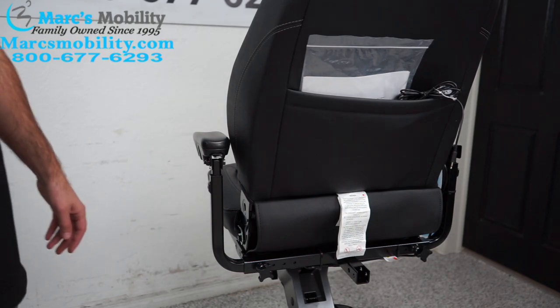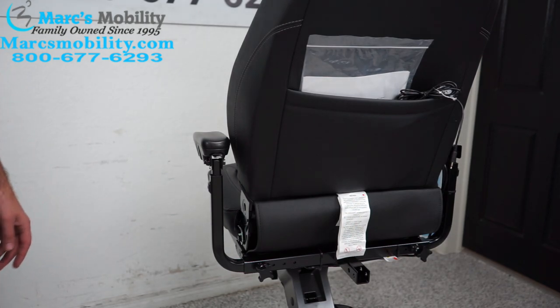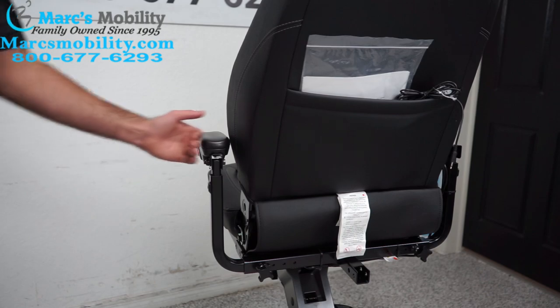Today I'm going to show you all the arm adjustments you can do on a Jazzy Air 2. We're going to start with finding out how to bring the arms out.